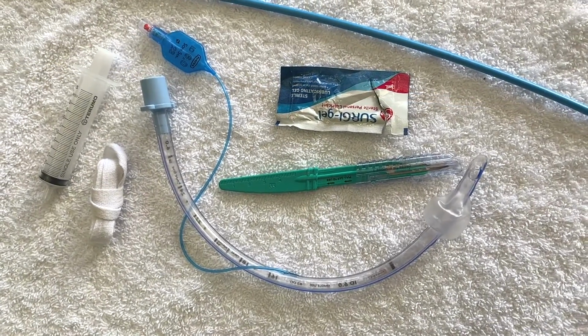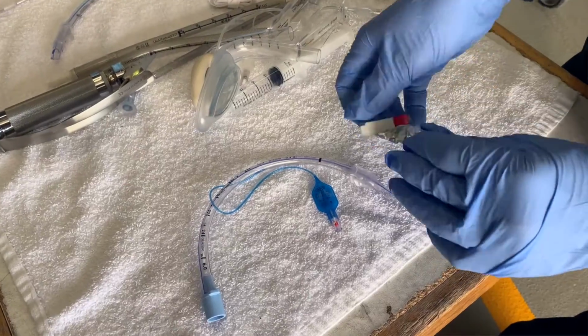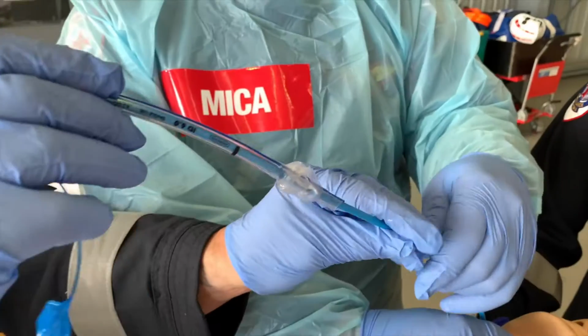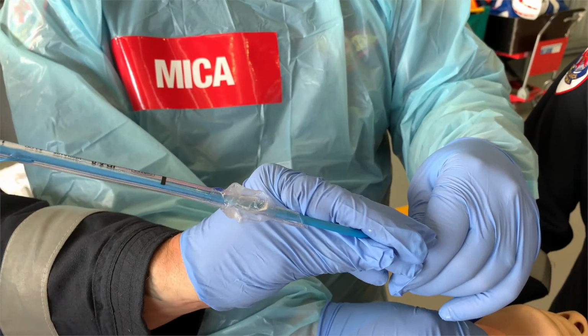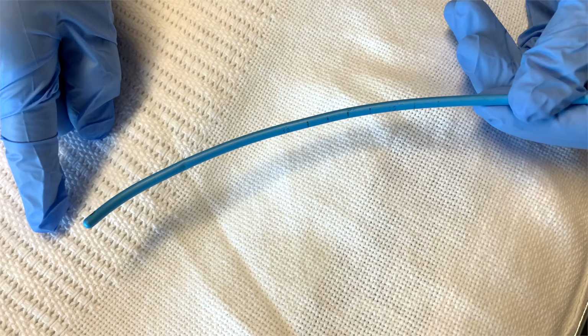Lay the pre-identified equipment out on a clean, accessible, and flat surface. The assistant applies medical lubricant to the distal ends of both the bougie and the ETT. Try to avoid handling the lubricant since it might reduce your dexterity. Ensure the bougie is reasonably straight and without hockey sticks or kinks.